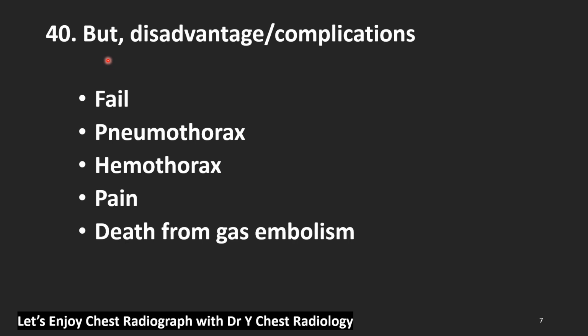I don't want to express myself about these disadvantages, but I have to tell you, they're really present. 1. Failure, according to the patient or according to the doctors. 2. Pneumothorax. 3. Hemothorax. 4. Local pain. And I don't want to say this one, but very, very rarely it sometimes happens: death from air embolism.